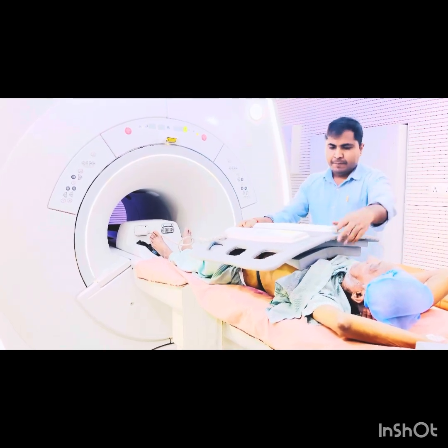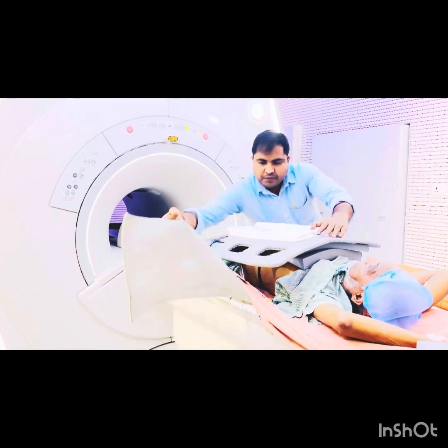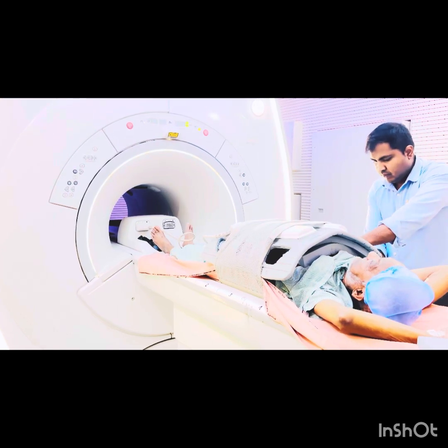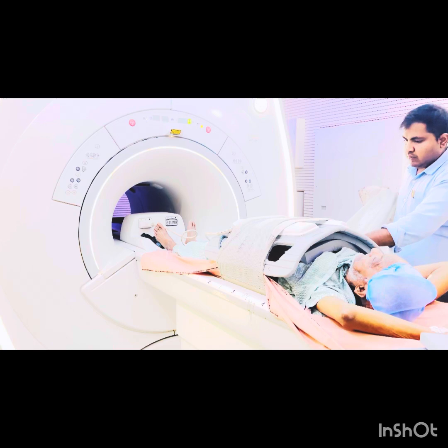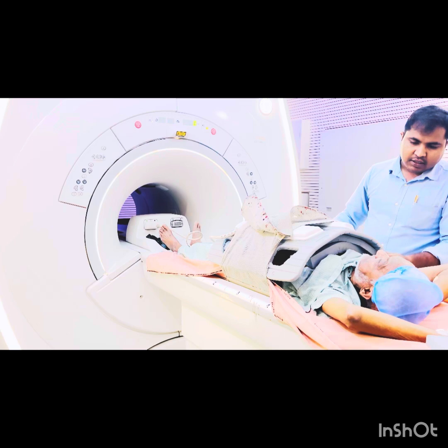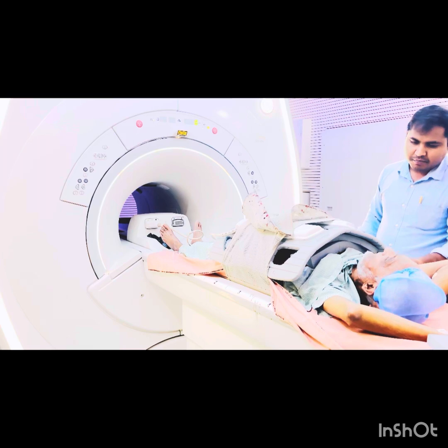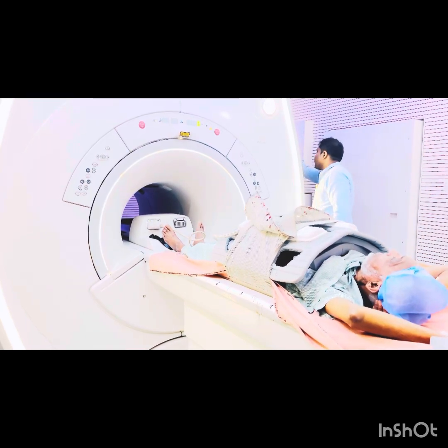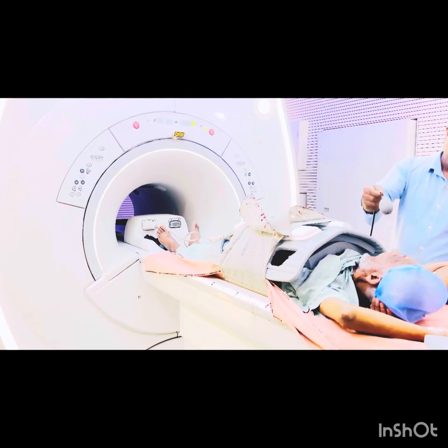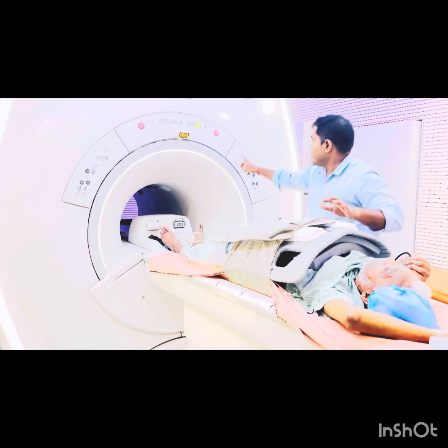First of all, we will make the patient ready in a hospital gown, and then take the patient inside. We'll use the respiratory gating below the diaphragm, and the body coils, as you see in the image, and wrap them easily. After that we'll give a balloon to the patient, and some breathing instructions to take breaths as an exercise. We give the patient one balloon for emergency alarms: if any discomfort arises, the patient will press it and we will come to discuss with the patient.